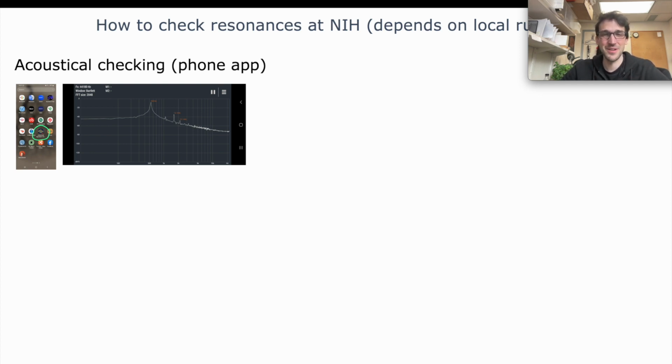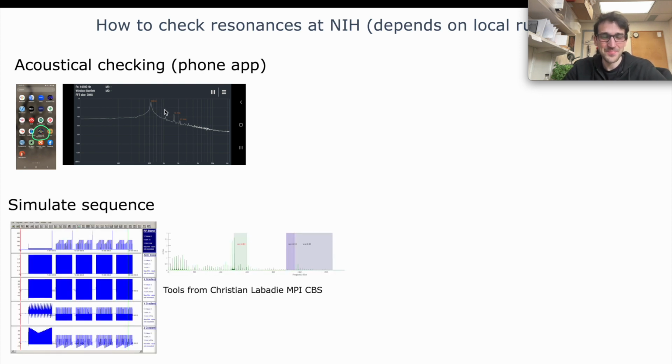And it's usually the frequencies around 550 hertz and 1100 hertz that are dangerous for the gradient, and therefore you want to avoid those. So here we are kind of close to it, but not too close. And this already brings us to the disadvantage of this method, namely that there's no clear cutoff. Like you don't know what is too close. How big should this kind of gain be in order to really stop the scanner?